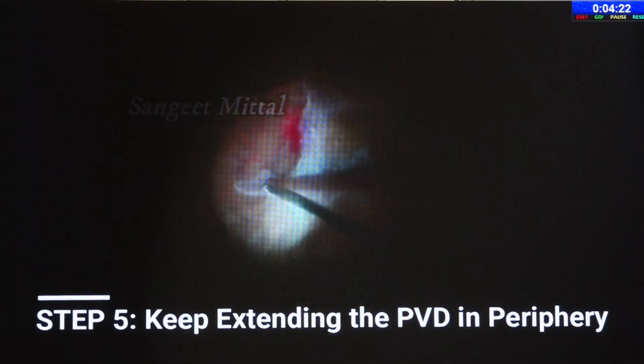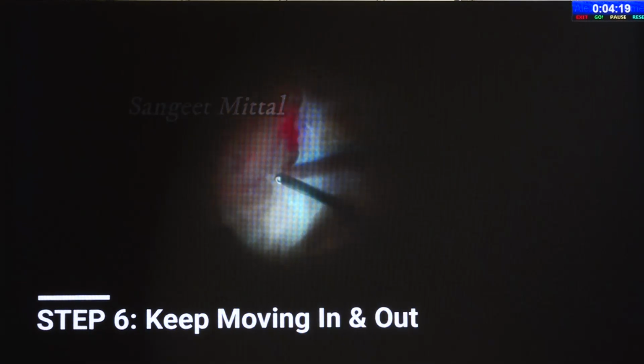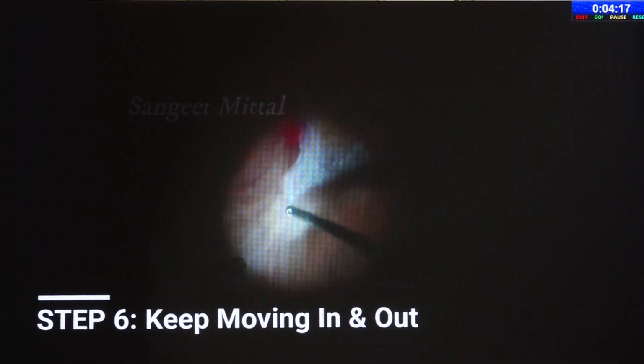So you can do a direct dissection, you can do a rollback dissection depending upon the membrane and the retina below. And you see such a big membrane, such a tough membrane. With this technique, you can dissect it very easily.